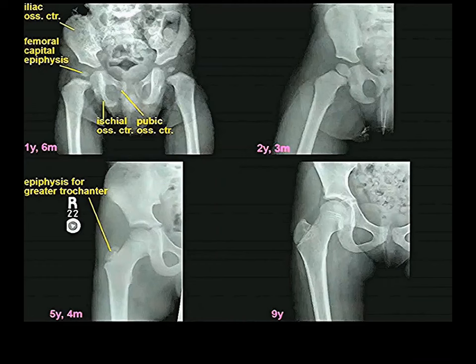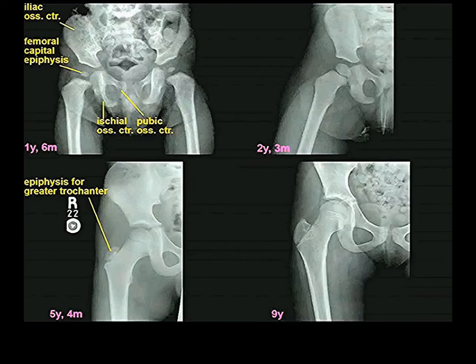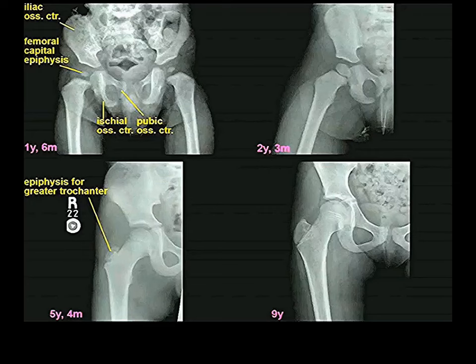These ossification centers start to approach one another. By the second year of age they still haven't met, but you can see a very tiny ossification center for the head of the femur. It's all cartilage forming a normal-looking head, but a little bony center is forming in the middle — called the femoral capital epiphysis.